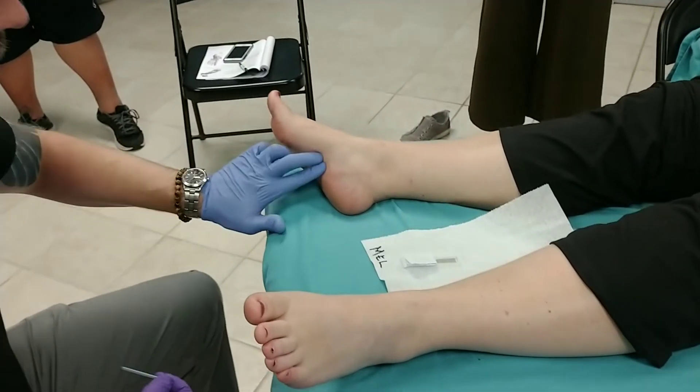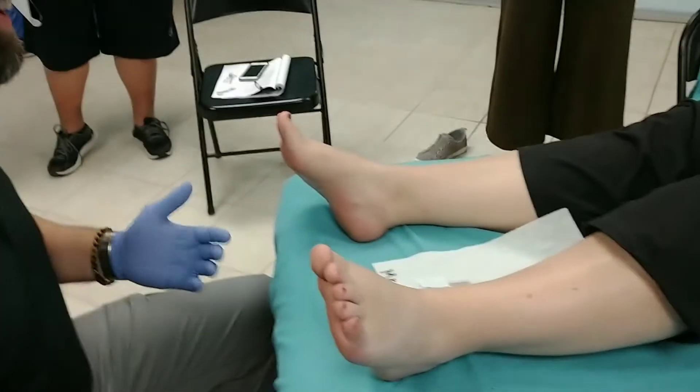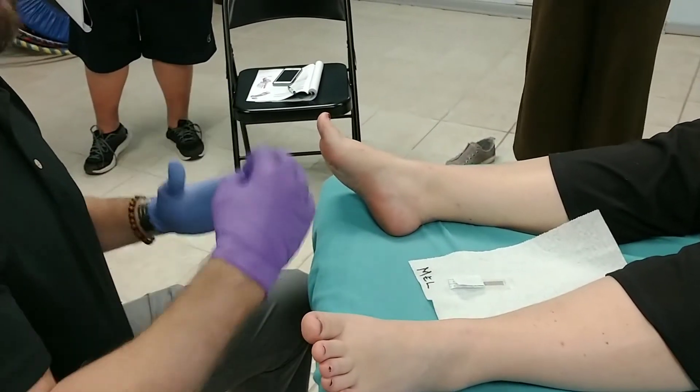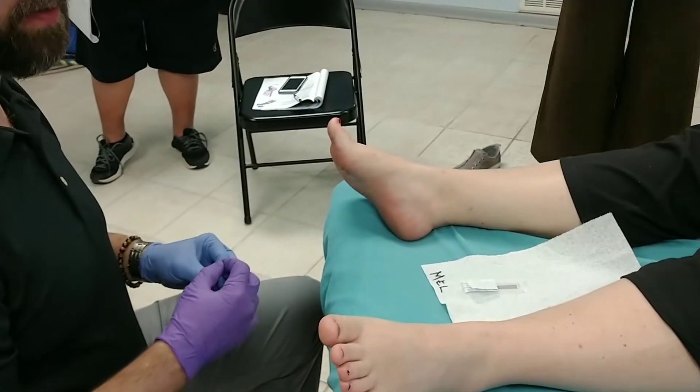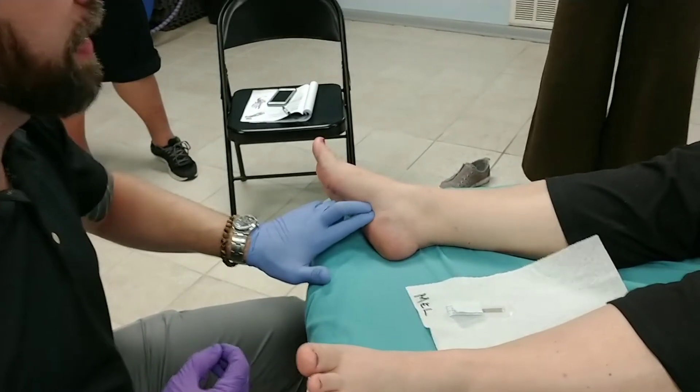I'm sorry in advance — that's what you should say to your patients. I much prefer to needle these from the side if possible. It's less painful than coming straight from the plantar aspect of the foot, like from Kidney 1 and whatnot.